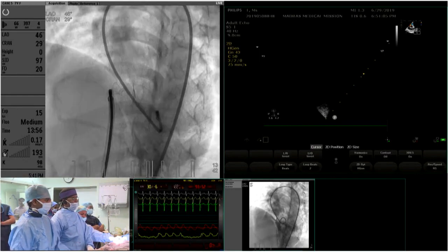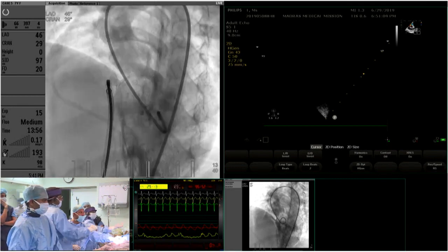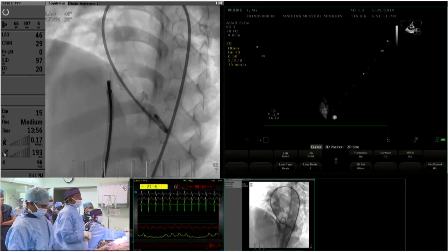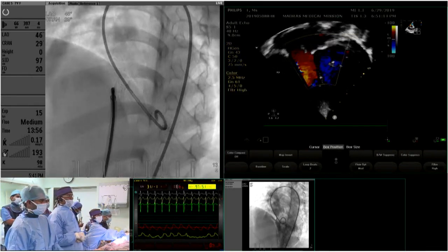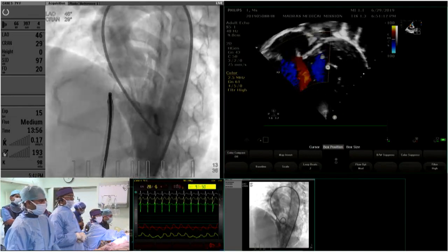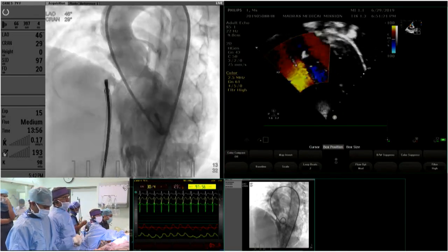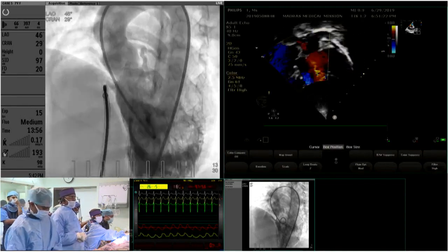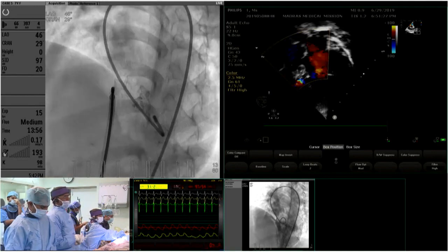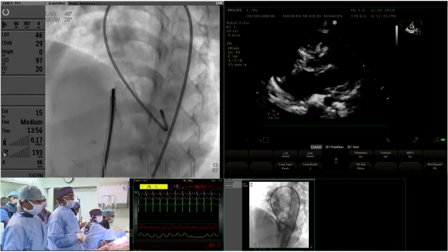Can you double check tricuspid valve, other valves, make sure no other issues? Tricuspid valve did not have any leak at all, Samir. I'll show you now. Yeah, it looked clean. Okay, tricuspid valve color. See, the tricuspid looked fine. Show the aortic. Aortic looks good. The device looks good. Short axis of good. The left ventricle. Yeah, color.